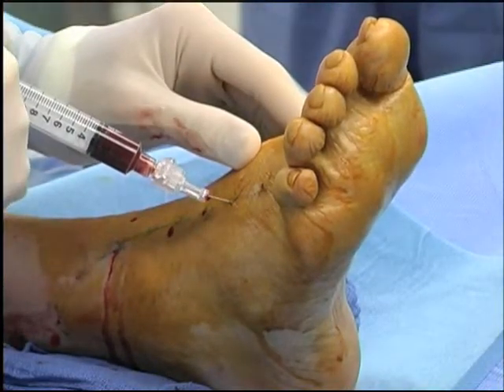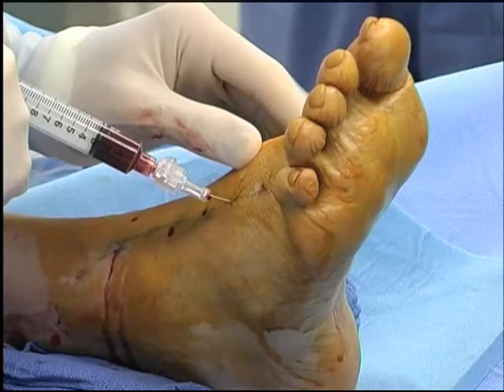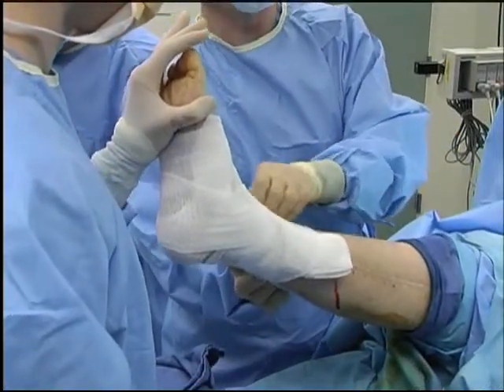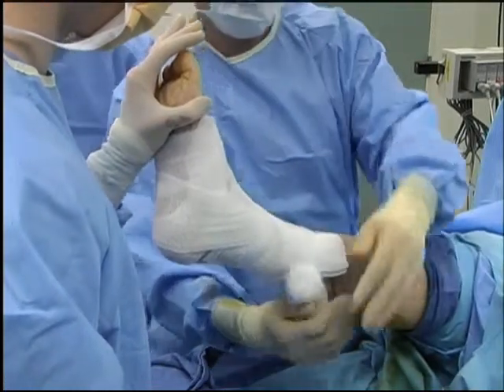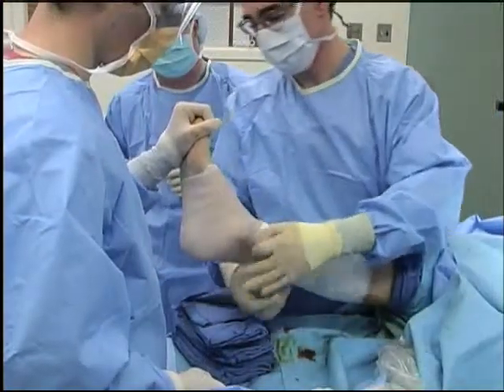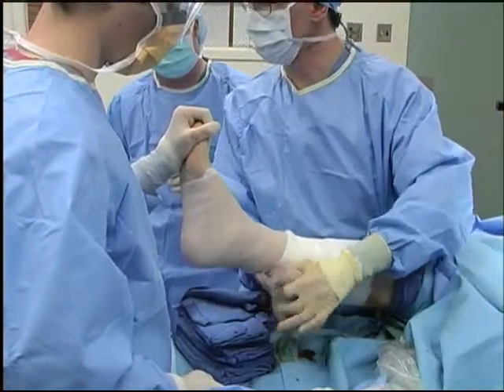Injection into the foot should be performed with a 26-gauge needle. The injection sites are to be covered with sterile gauze and the leg wrapped loosely with a sterile gauze roll. If wounds are present, they will be dressed according to the attending surgeon's protocol.